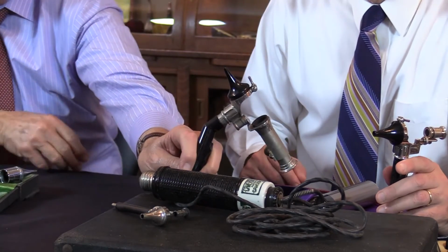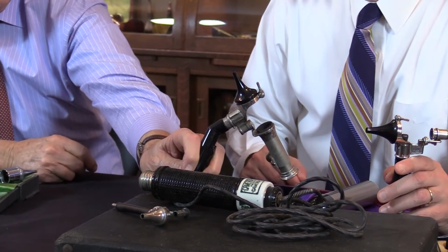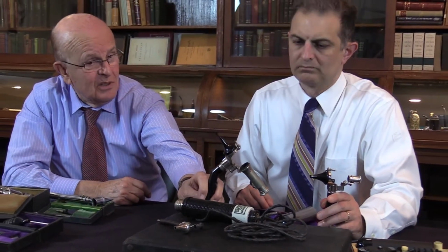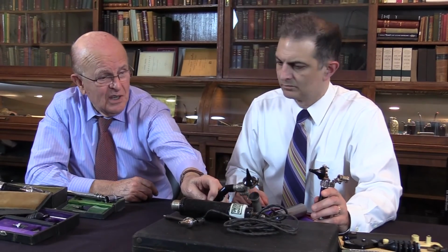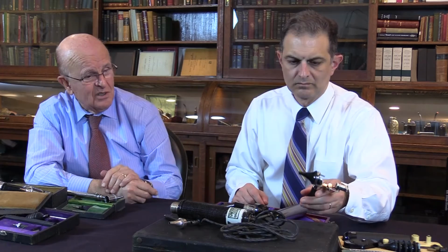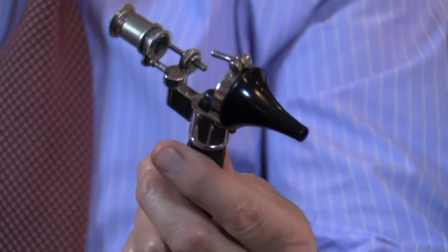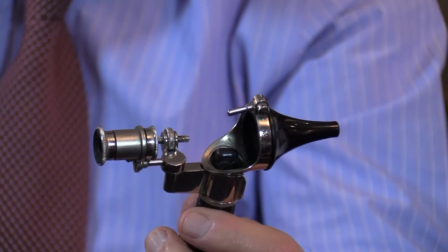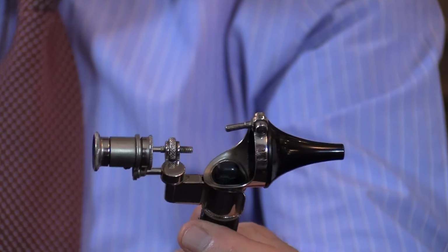In fact, around the turn of the 20th century, they attempted in Vienna, in Austria, to do stapedectomy. And this is what they used. They didn't have a microscope or anything. But I bet you, rather than this, this is what they used at that time. This, to me, is one of the most important steps in magnification of the eardrum.